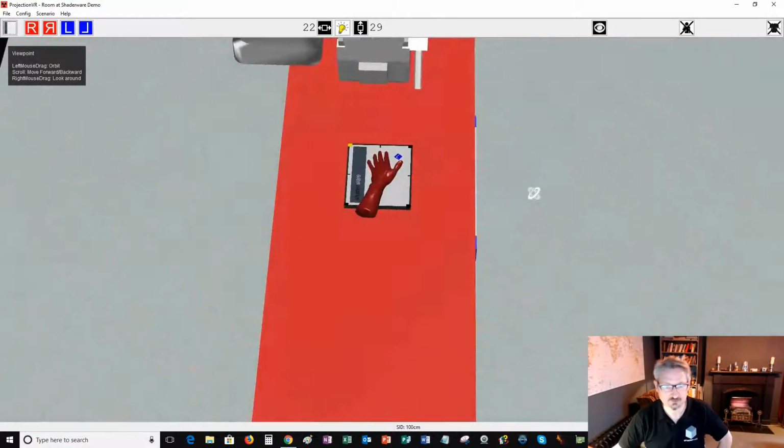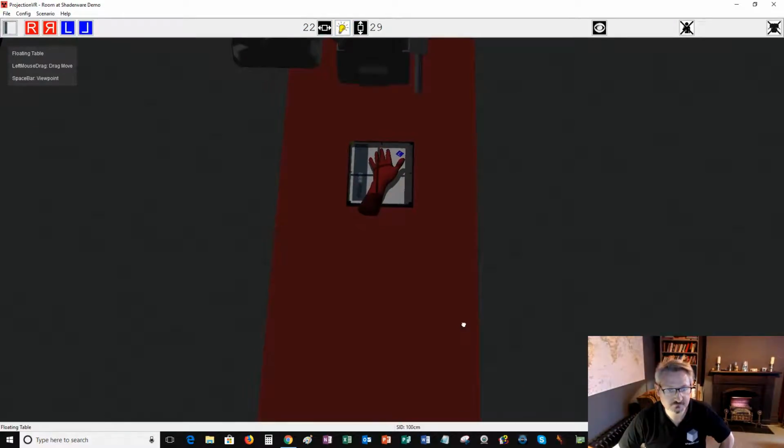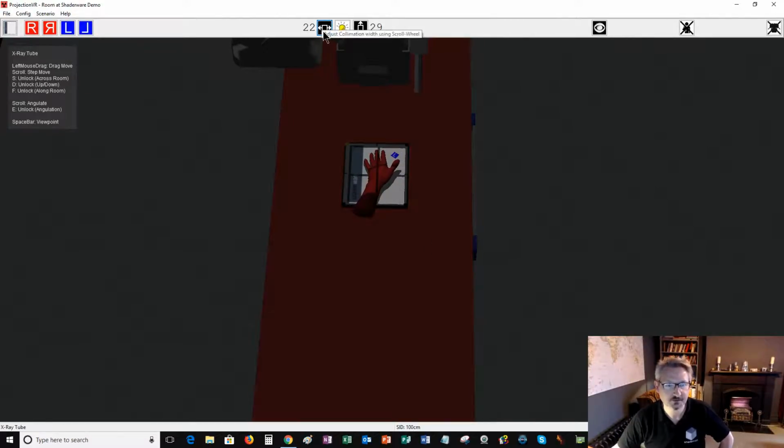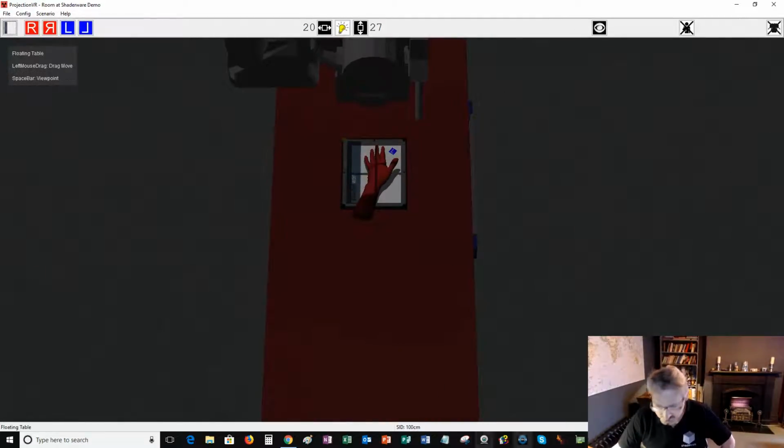So something like that for the oblique. I'm going to set that. Certain textbooks say to aim at the fifth, but I'm going to still center for the middle of the hand. I think I might want to make that a bit steeper as an angle. Okay, so I'm reasonably happy with that as an oblique hand.